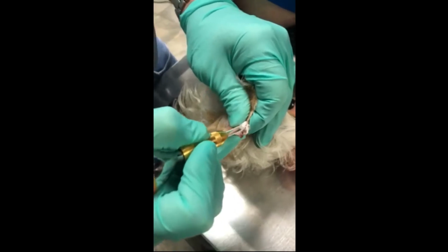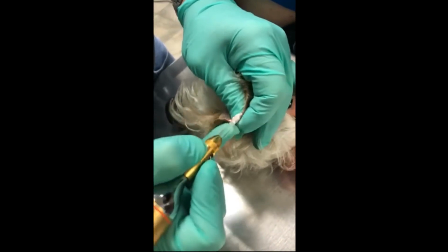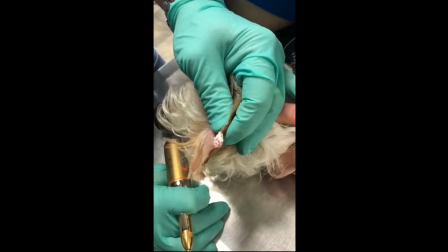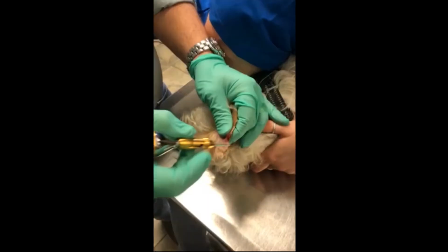How are we doing, Heather? Okay, so there's a 40-second freeze. We're going to shut the video and come back after the thaw cycle.